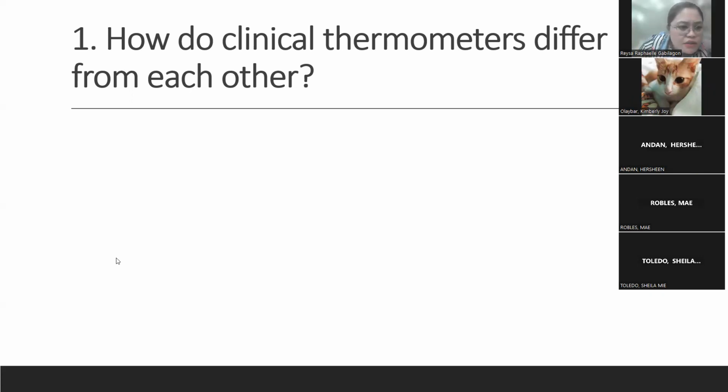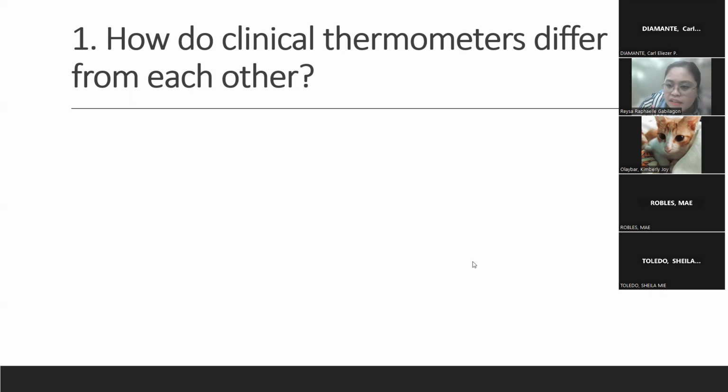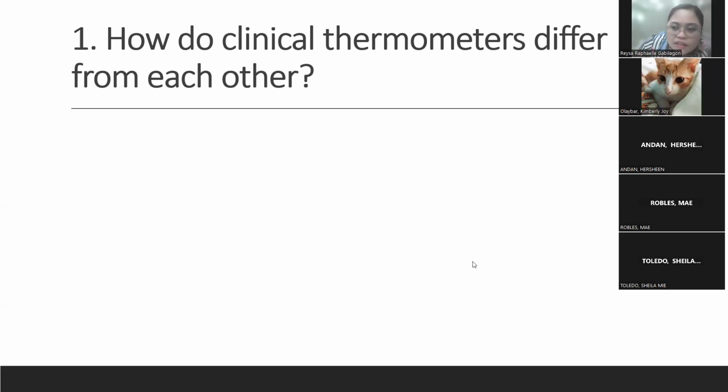Yes, Carl, yung nag-raise ng hand. Go. Ang iba-iba na thermometer, ma'am, is mura tong gamay na thermometer, gina-measure lang niya in between human body temperature. Kung masubra na siya sa temperature, mag-indicate na siya ng high na lang. So wala na gina-indicate kung gaano kataas. Iba na pong thermometer like sa water bath or something, indicate niya yung katasaan na yung temperature.